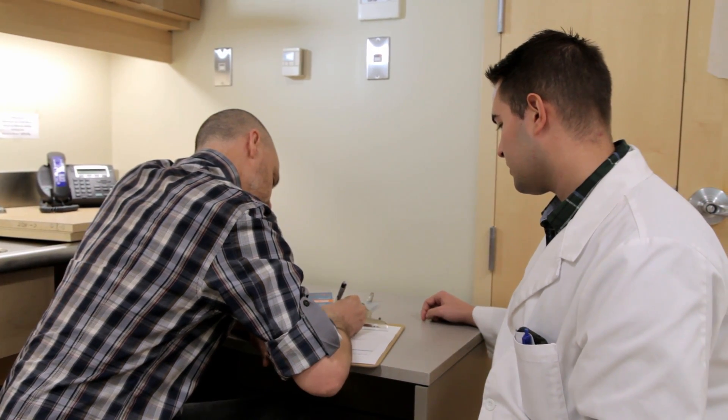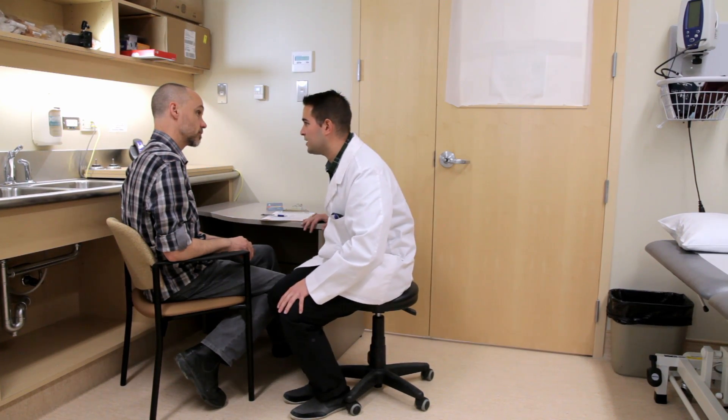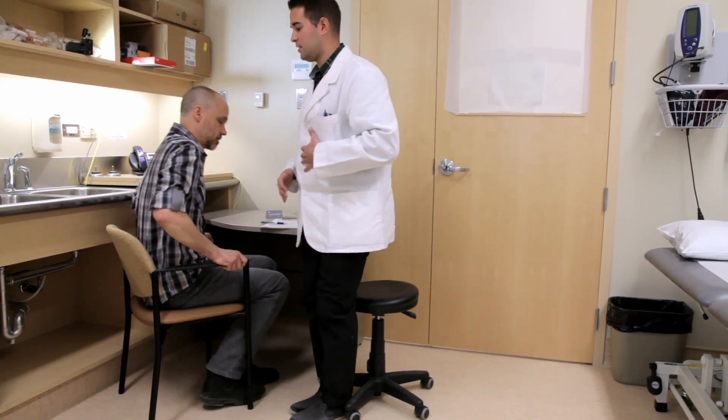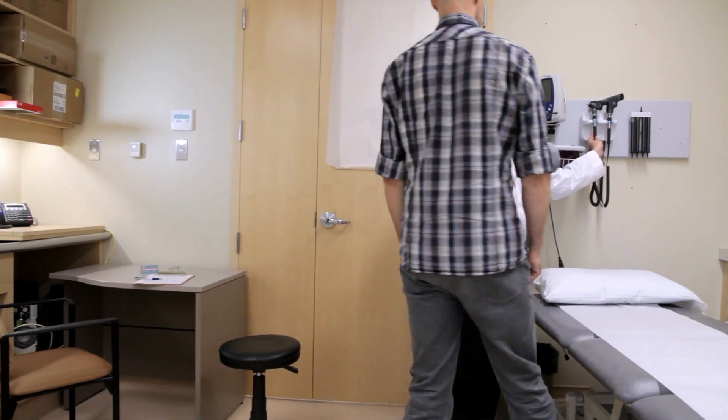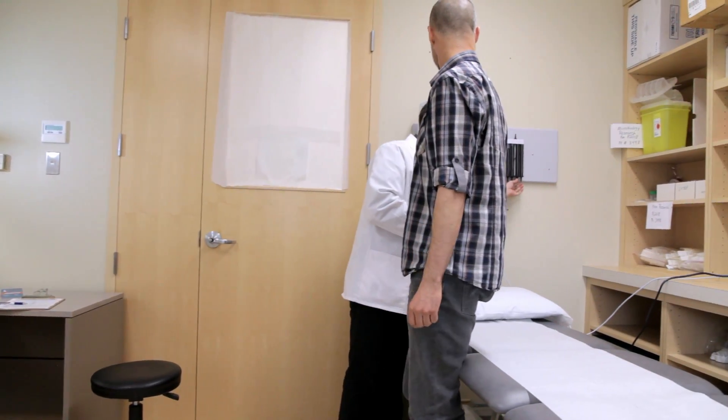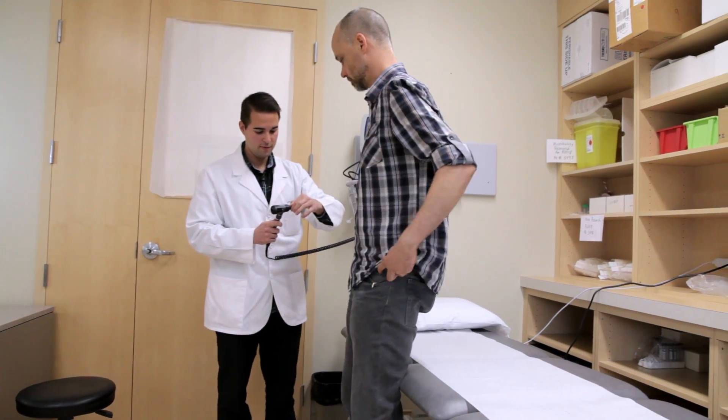Hearing loss can develop slowly and subtly and requires regular monitoring. Industrial audiometric testing provides a means of early detection of noise-induced hearing loss. Early intervention and education regarding noise reduction in the workplace are key components in maintaining a healthy work environment.